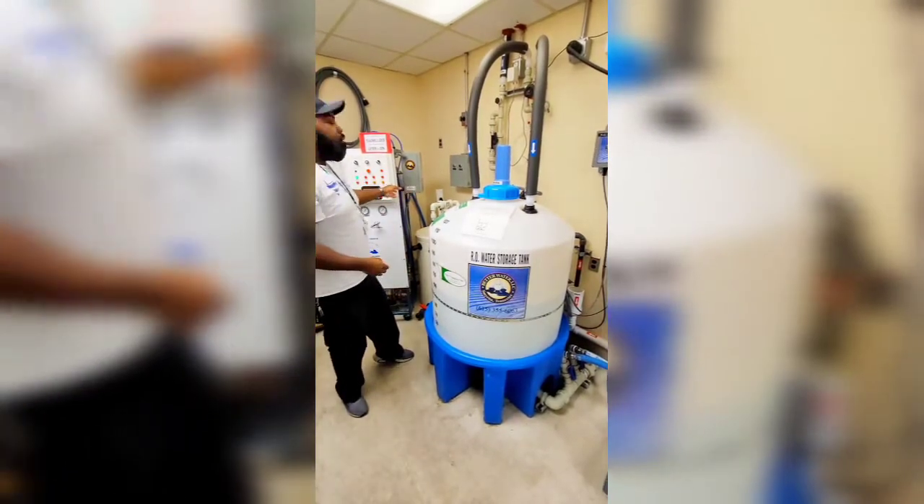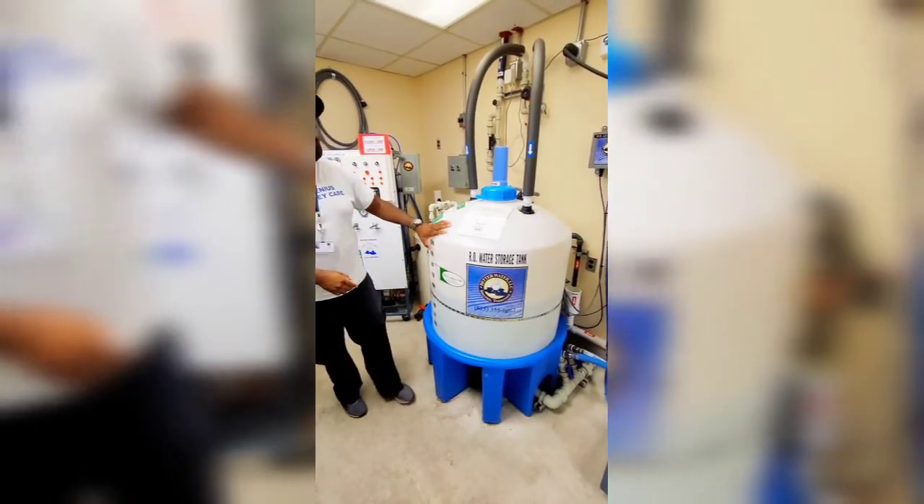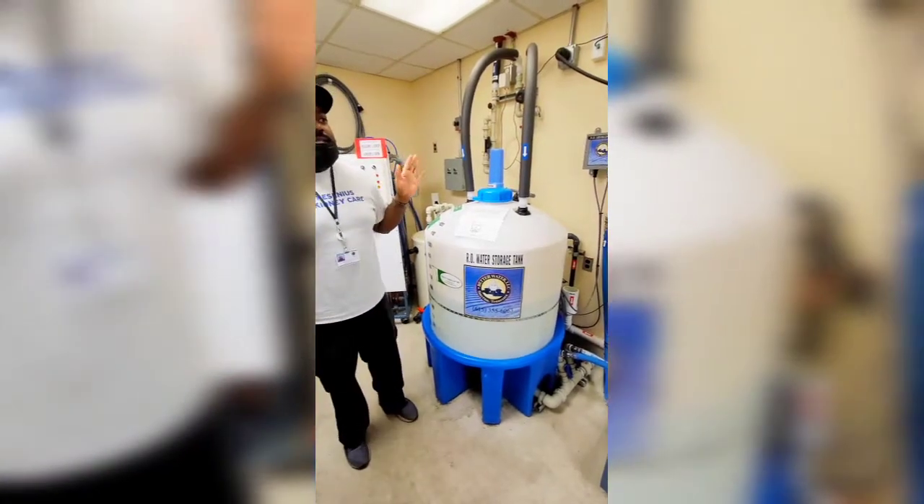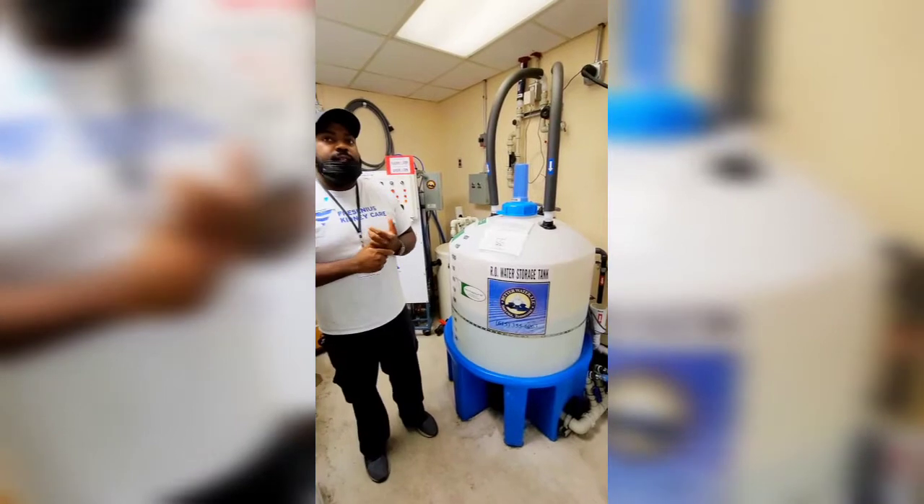As the water gets used, the RO will kick in and fill that tank up again. And that's pretty much the gist of all that. Are there any questions as far as that goes?